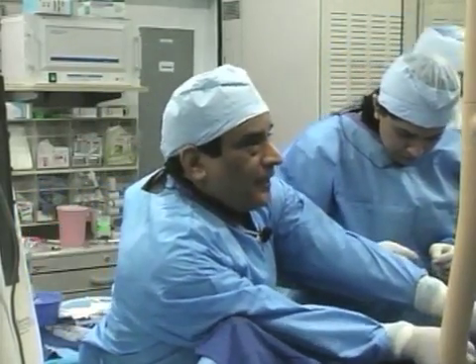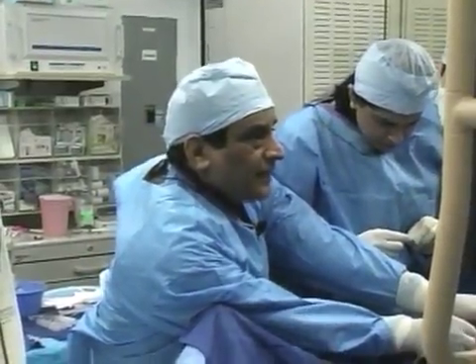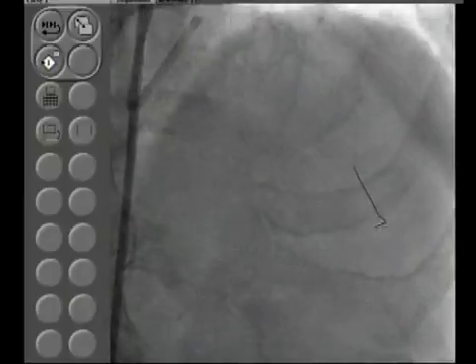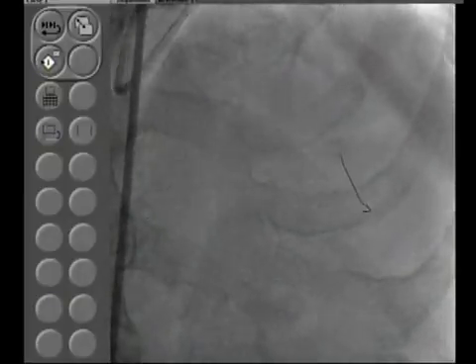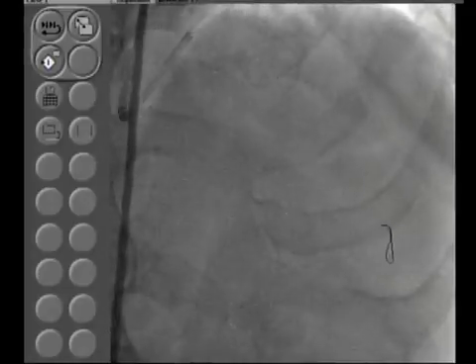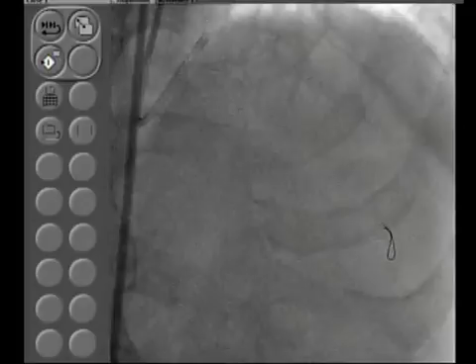One of the important indications will be whether the stent has been endothelized. I think that's a very important case. A high risk patient going for surgery, where the endothelization of the stent struts at follow up may be useful. What about the evaluation of thrombus? And I would say absolutely yes.